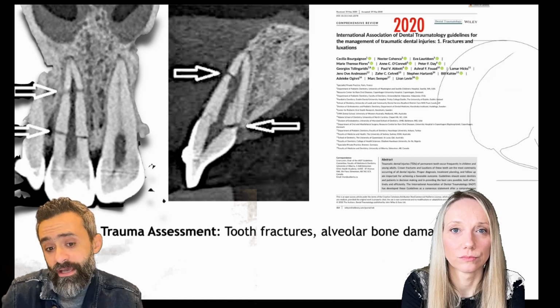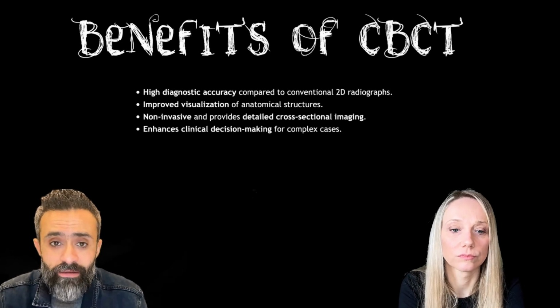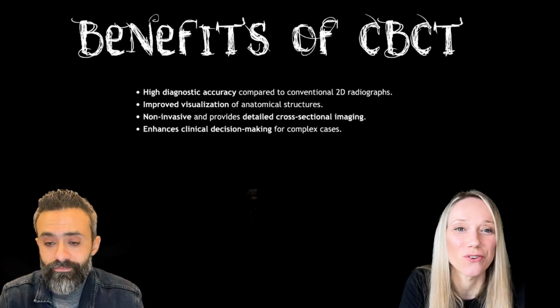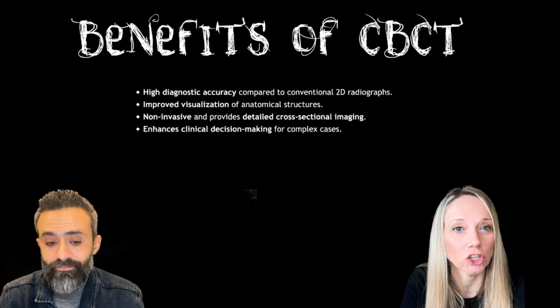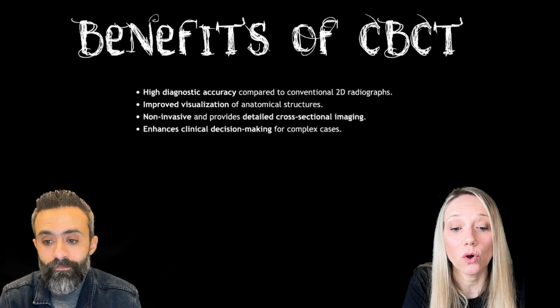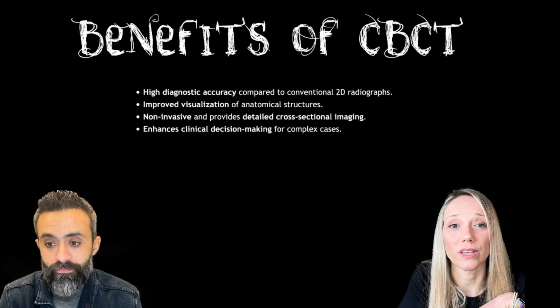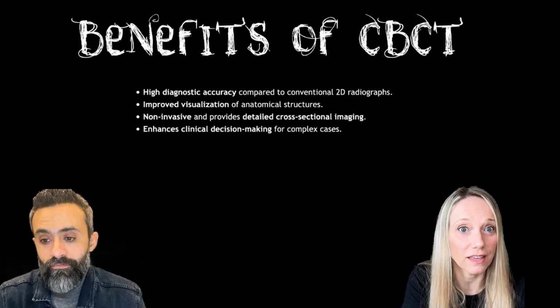So now, Francesca, can we summarize the benefits versus the limitations of the CBCTs that we use in daily practice? Of course. Well, of course, the accuracy, because a three-dimensional scan can be extremely more accurate than a conventional bidimensional image. And then we can see the anatomical structures in a better way. We have an improved vision. And also, you have to say that this is a non-invasive instrument. So we can do it without harming the patient, because the dose of radiation that we give to the patient is extremely controlled.